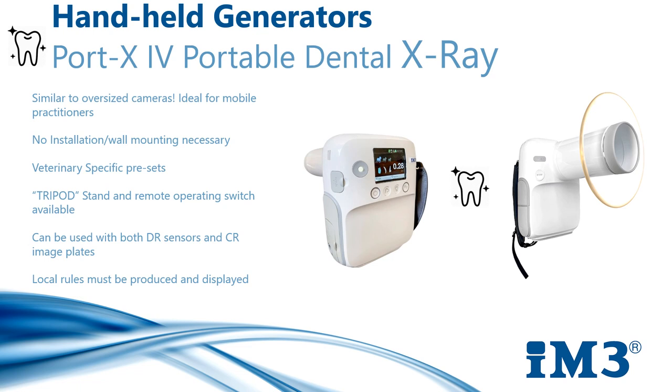The Port-X is nice and light, weighing only 1.5 kg, which enables total portability. It has built-in safety features including a lead-lined tank and tube, and is also supplied with a backscatter shield. It comes with a tripod so you have the option of a remote operating switch. As with the mobile and wall-mounted generators, this can be used with both DR and CR image plates.